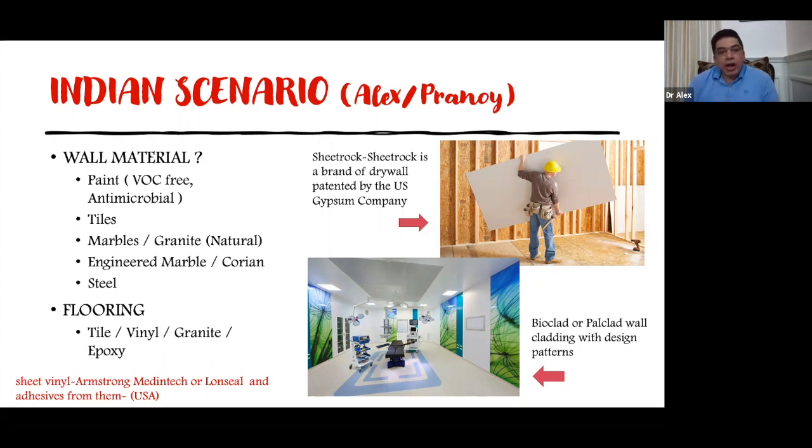These are kind of sheets that can be pasted on your existing wall by experts. And also for the floor, you can use the same kind of sheet vinyl. But everything depends on the availability and the maintenance that can be given by the company that you are asking for the material.